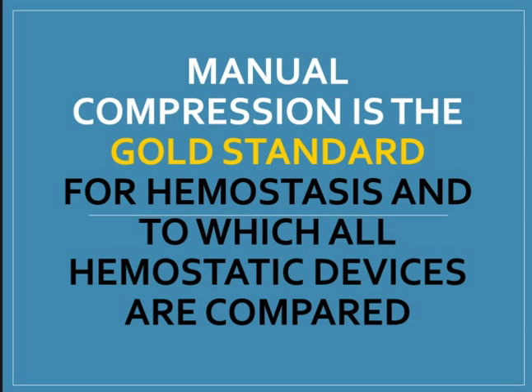So manual compression is the gold standard by which hemostasis is achieved. Fem stops are nice, but they are not the go-to. Preferably, you should always use manual compression. Your fem stop should only be used as an adjunct when you have successfully exhausted all manual compression efforts.